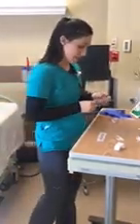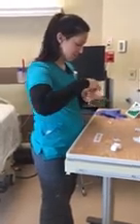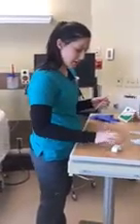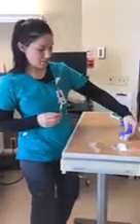Perfect. Okay, the next thing I'm going to do is swap out my filter straw. And I'm going to dispose of that. And I'm going to reattach my needle here. Okay, now I'm going to head to my patient room with my needle and my gloves and my gauze as well.